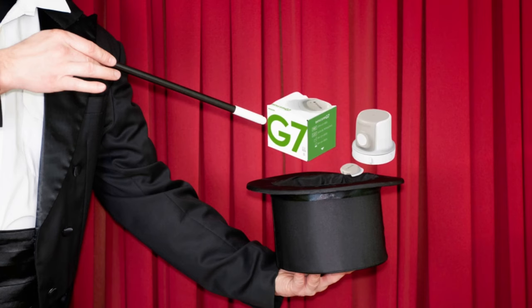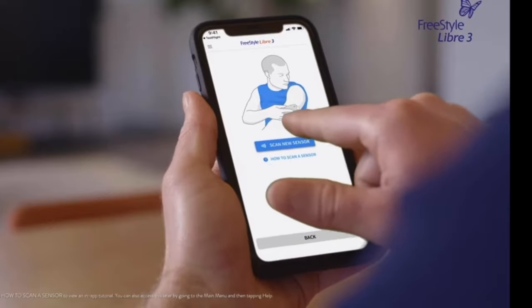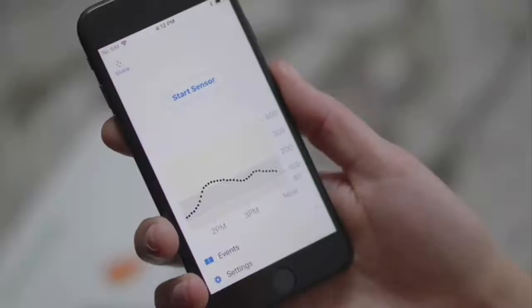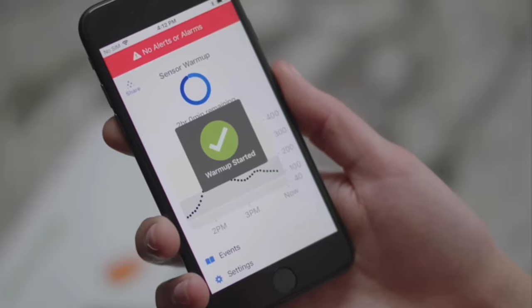Once the sensor is on the arm, this is where a little bit of magic happens. With all other continuous glucose monitors — the Freestyle Libre, the Dexcom G6 — once you apply the sensor, nothing actually happens until you initiate a further step. With the Libre, you had to scan the sensor to get it started. With the Dexcom G6, you had to press that little start sensor button. And a lot of times if you forgot to hit that, maybe a few hours went by, you lost all of that time — the sensor did not start until you actually activated it.